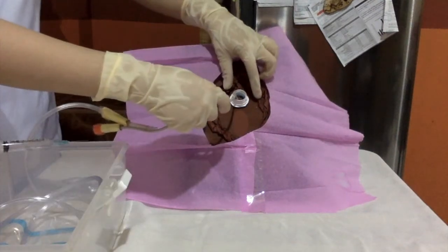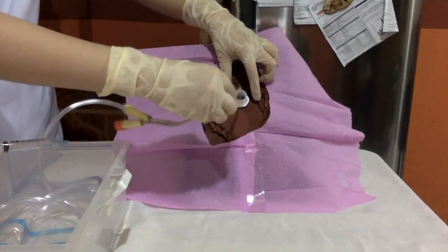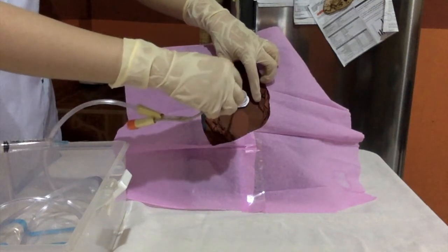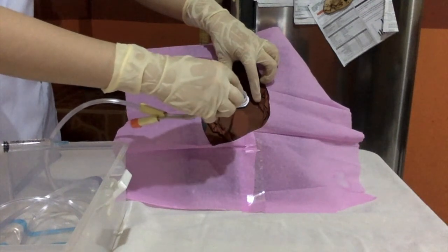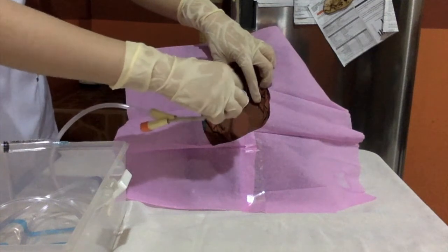The urine has returned and I will advance 1 to 1.5 inches more to ensure that the catheter is advanced far enough not to be dislodged and for safe inflation of the catheter retention balloon.